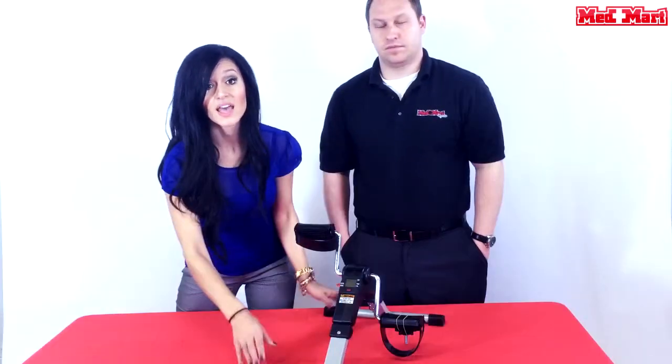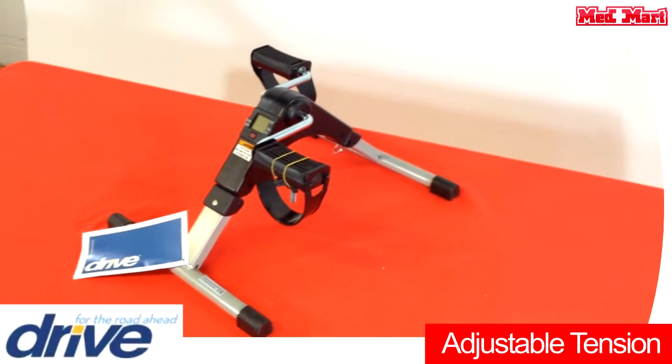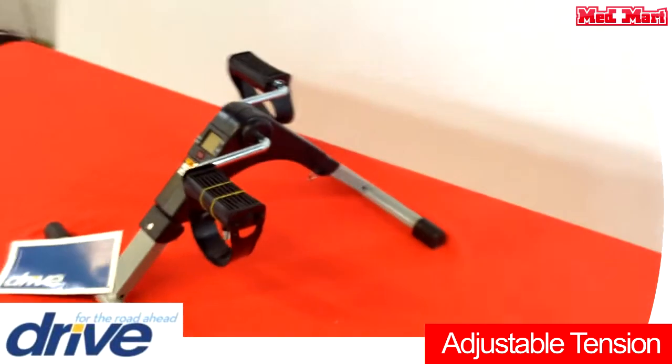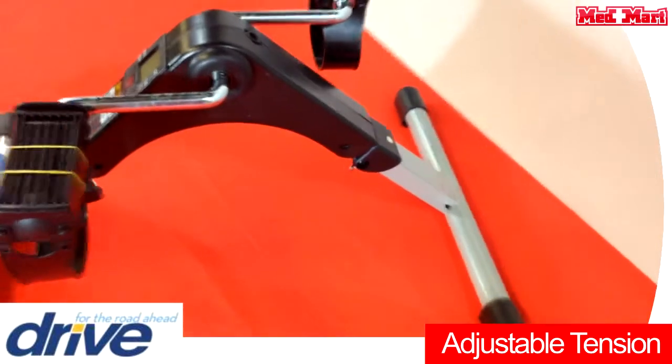If you also look at this Exercise Peddler, you will notice there are rubber anti-slip grips. Any surface you place this on is not going to get dinged up — that's what these are here for. You can also adjust the tension with a knob that you can turn, making it more or less of a challenge depending on your individual needs.